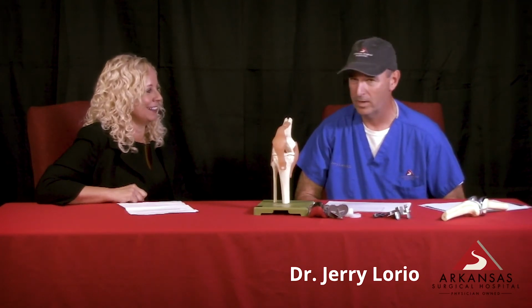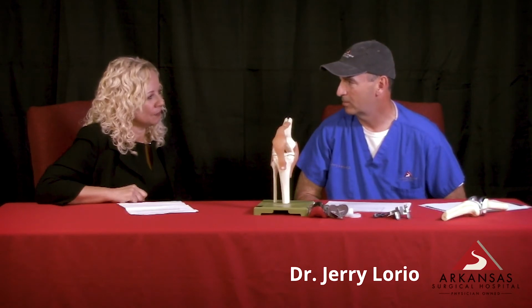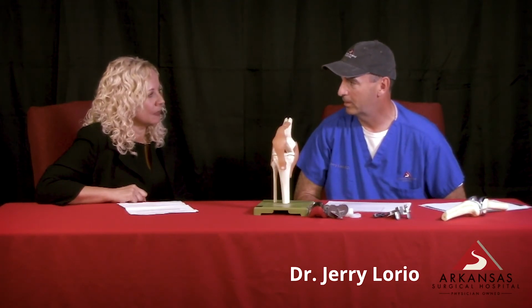All right, so it looks like we have another question coming in. Let's see. Kay would like to know if you recommend the machine used at home. Yeah, I think that's something that I've always used, a continuous passive motion device. We use it in the hospital. It moves your knee when you don't feel like it. I do it 2 hours twice a day for the first 3 weeks after surgery. And it's got to be fit to your knee so that it's comfortable. But for most patients, that's a good experience. Probably if we didn't use it at all, you would still get some good motion. But there's certain people, I think it really helps get them going when they wouldn't move it.